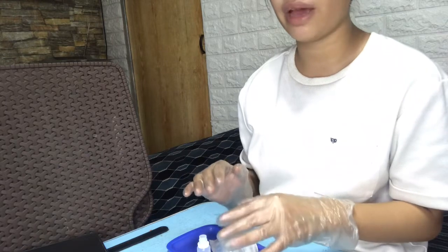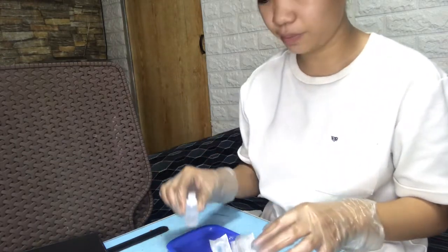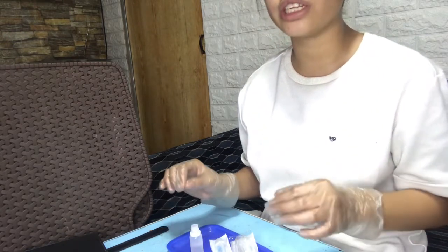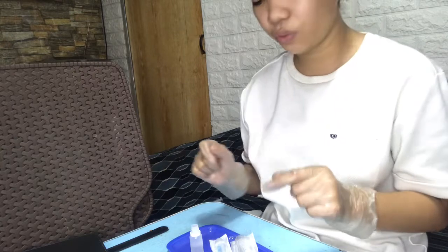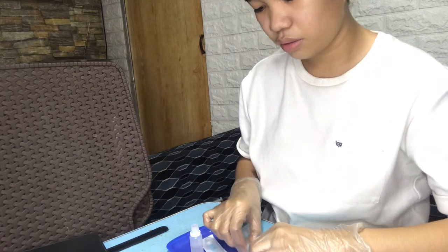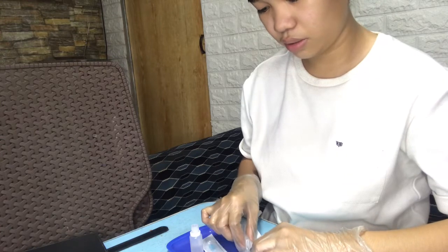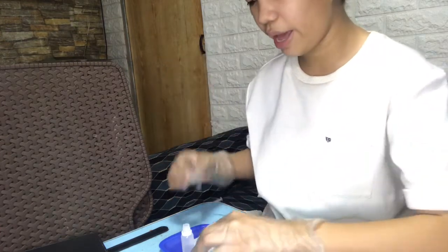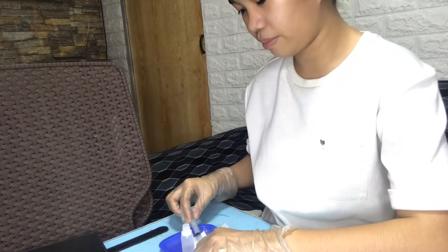Next, withdraw the medication. Place the ampule on a flat surface. Let's place this one. Next, attach the filter needle or the straw to the syringe. So first, let's get this one and then attach it.